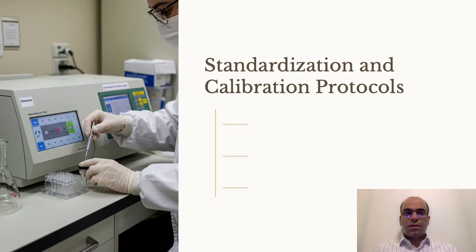Now let's see standardization and calibration protocols and what they are about. Proper standardization and calibration are essential for accurate immunoassay results. Following these protocols ensures consistency across multiple test runs and different laboratory environments.